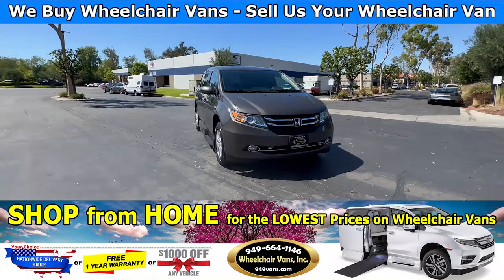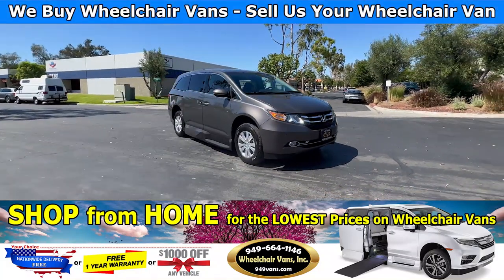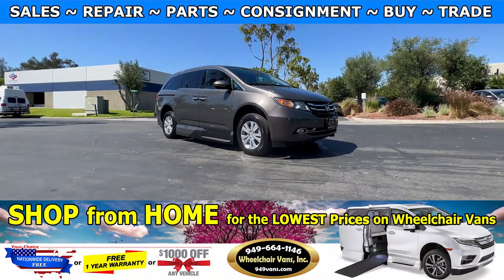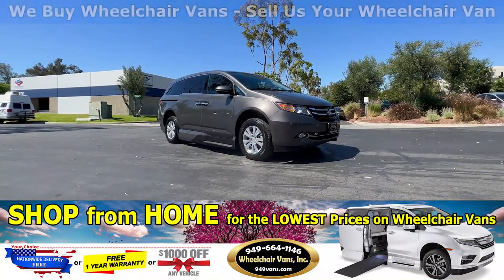Hello and welcome to Wheelchair Vans Inc. Today I will be going over a 2014 Honda Odyssey Touring Elite equipped with the VMI Northstar in-floor ramp.